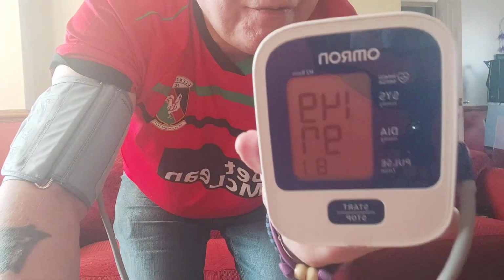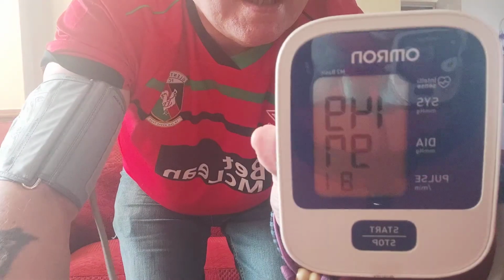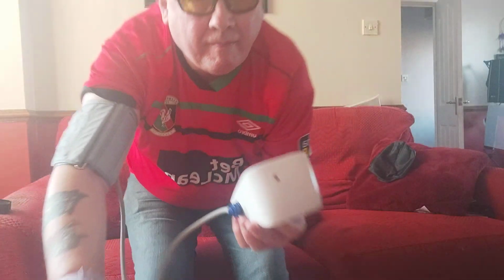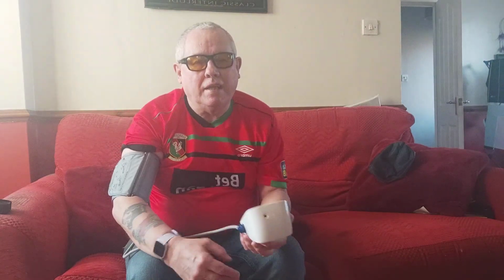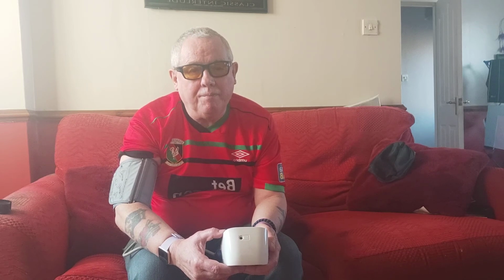That's actually higher than I thought. 149 over 97. And as you can see, the last one is 81. Now, I'm going to sit here a wee minute and talk to you, and then I'll take it again, because I sort of ran up the stairs. Well, I didn't run up the stairs, I haven't run in ages, but I'd gone up the stairs to get my blood pressure monitor, and I haven't really had any water yet. I've sort of woke up, I've had my toast for breakfast.